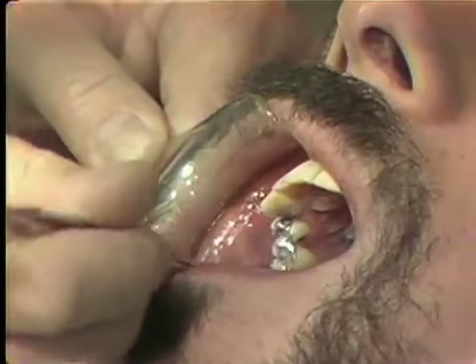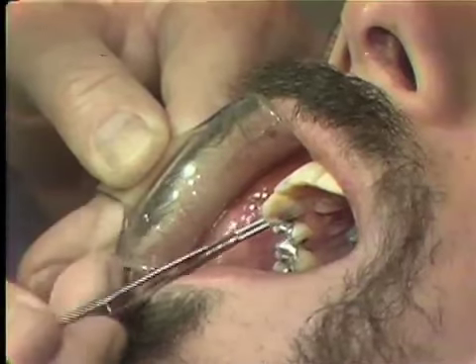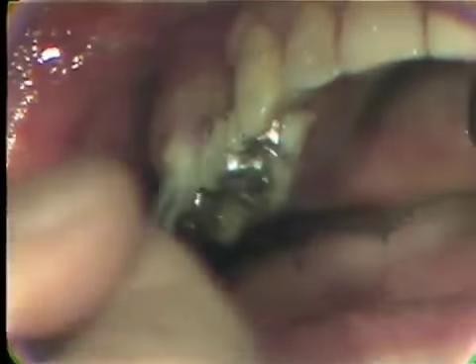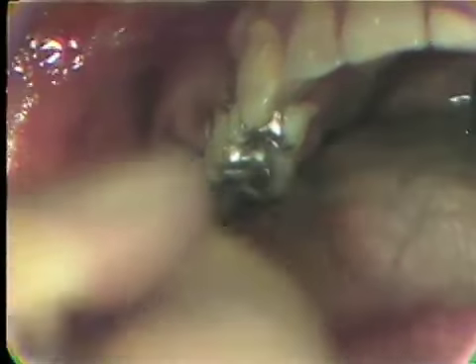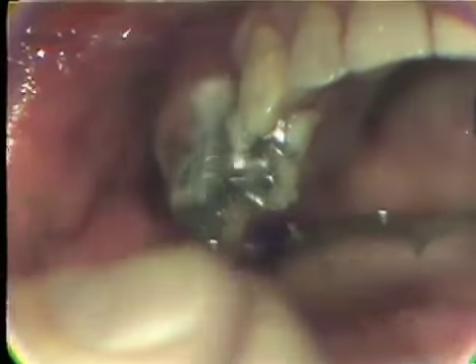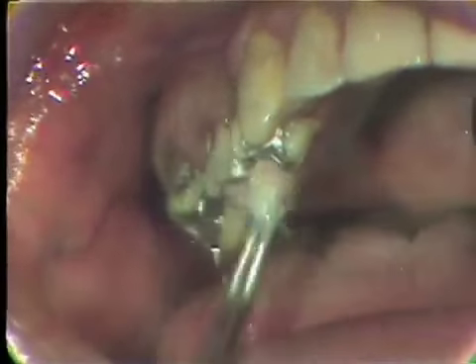It's well to put on a very liberal application of this lubricant. You would not want the Duralay to set or stick to the teeth.